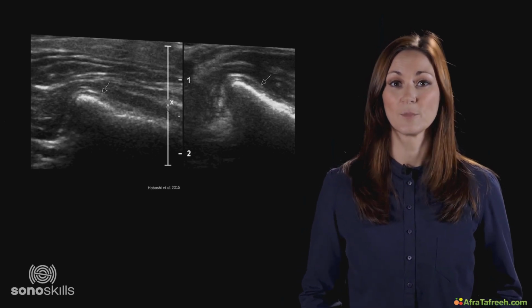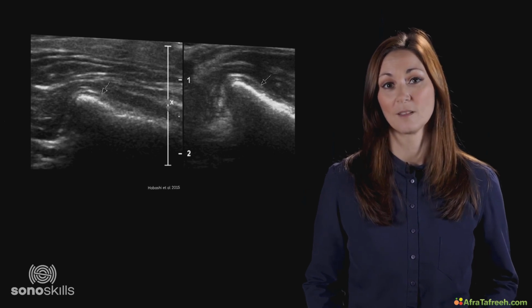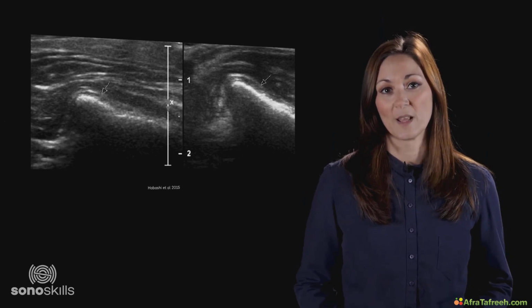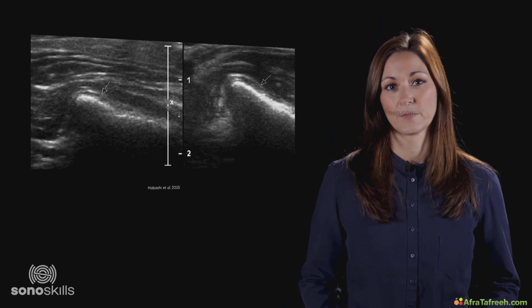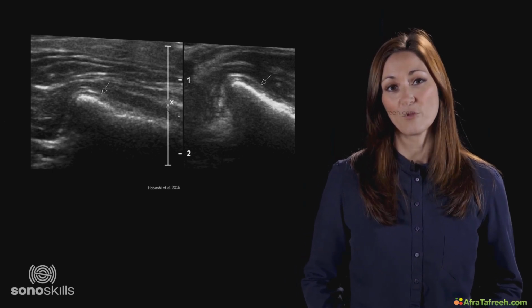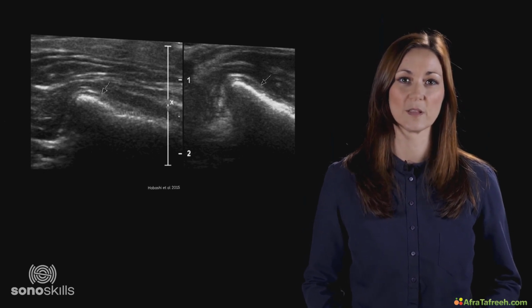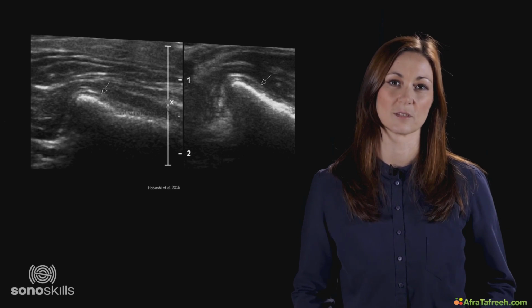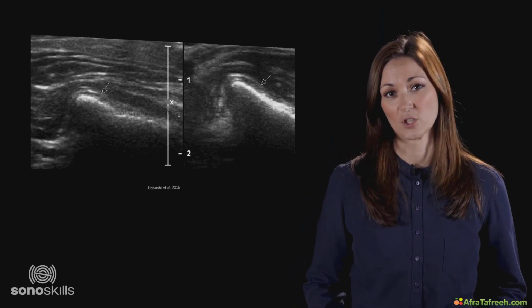Scanning the temporomandibular joint and its disc kinematics during functional movements can be done, but it is much more complex and requires lots of experience. The temporomandibular joint is a closed joint. The presence of bones prevents a clear view of the soft tissue structures. The disc is small, and scanning the disc during movement is challenging.